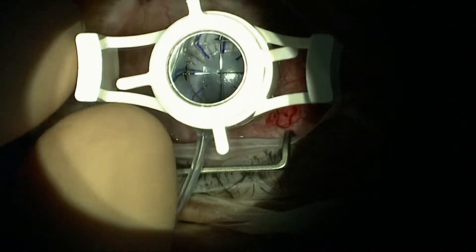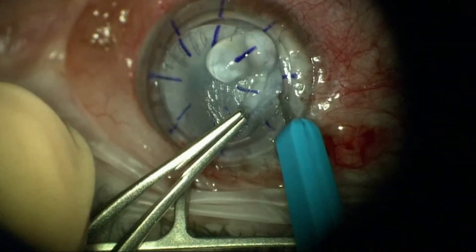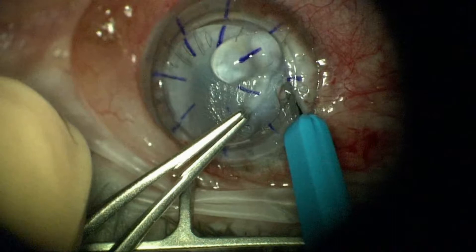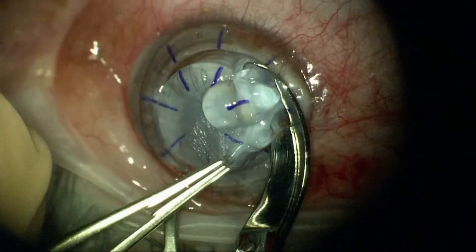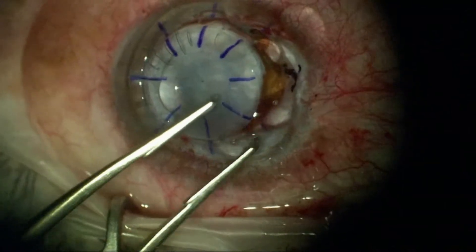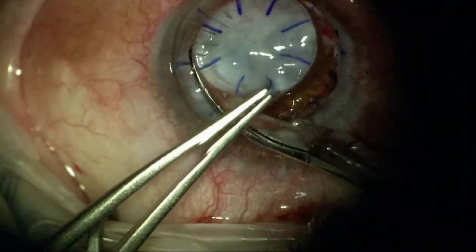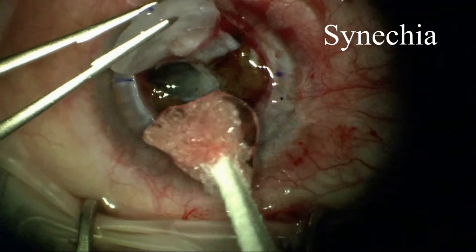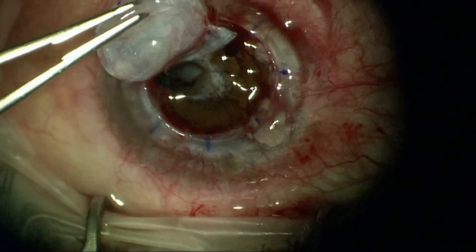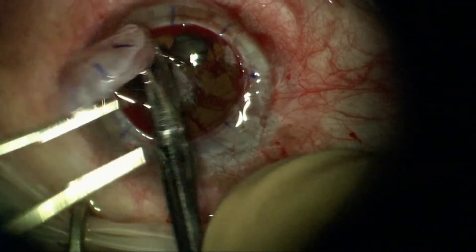Here to regain quality of vision and try to improve the overall internal structures of the eye, doing a controlled entry. You can see the very thick failed cornea here, and you're also going to see a lot of scarring inside the eye — anterior and posterior synechia — these need to be very carefully lysed.